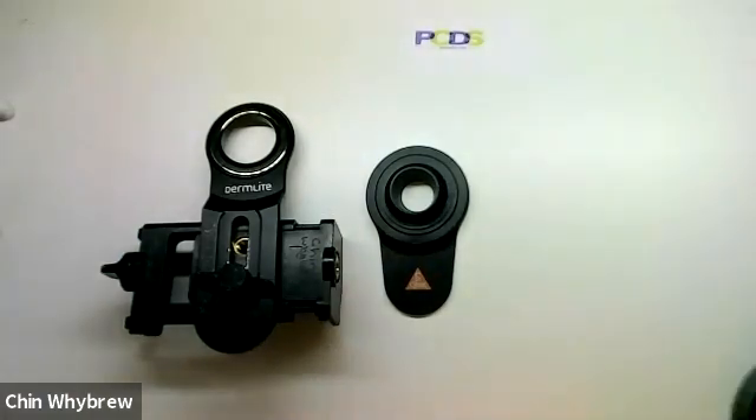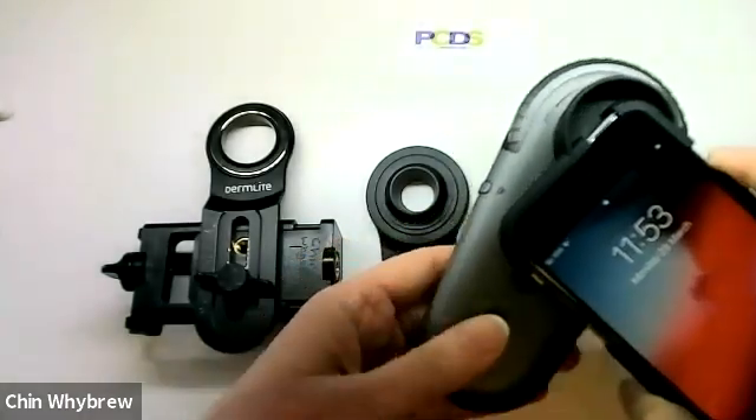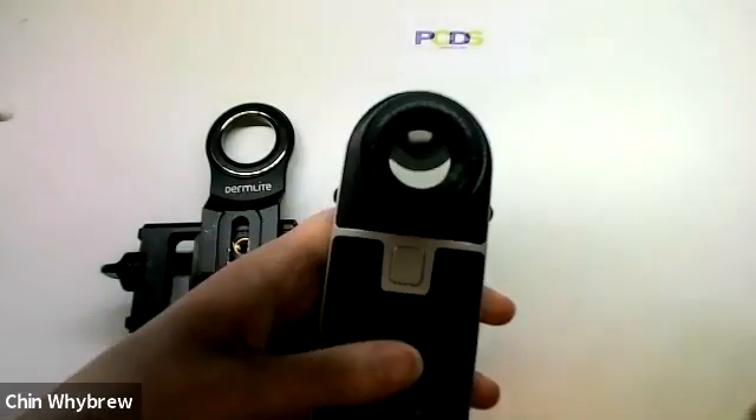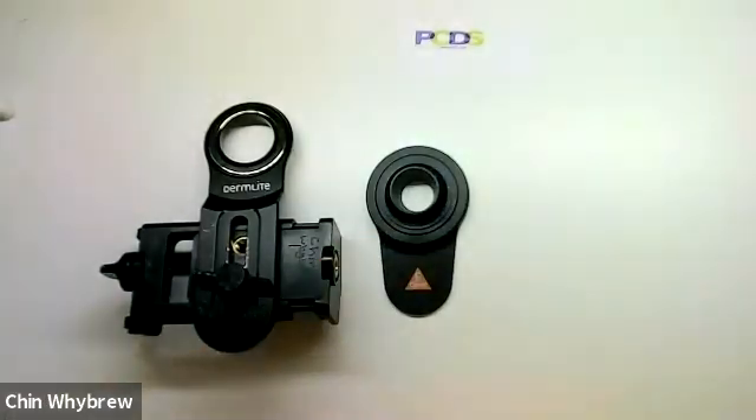This one is the Iluco IDS 1100 and it attaches very nicely, and this one is the Heine Delta 1 and it will attach to that very nicely. Those are the three dermatoscopes which are currently the market leaders for the moderately priced hybrid dermatoscopes.